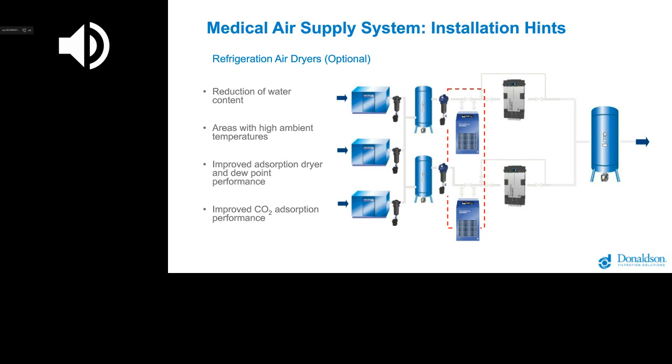And that's also interesting if you are running a dryer with a dew point control system. Then for the dew point control, you should always set the value at which you switch over from adsorption to the regeneration cycle as a relatively low value. So our recommendation is that it should be in the range of minus 40 degrees pressure dew point or even lower.